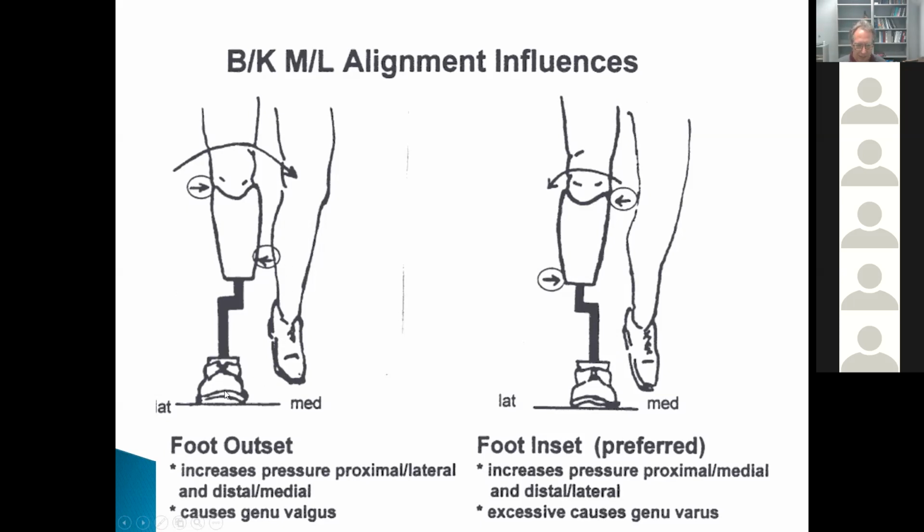But an outset, and you may do this if you see too much inset, and we're going to look at the videos in a week or two, and you'll see examples of both. You saw some video stills from this particular video that is showing too much abduction of the socket. But if we have too much outset, which should actually be an abducted socket, so the foot is lateral to the socket and the foot is lateral to the center of mass, two things happen.